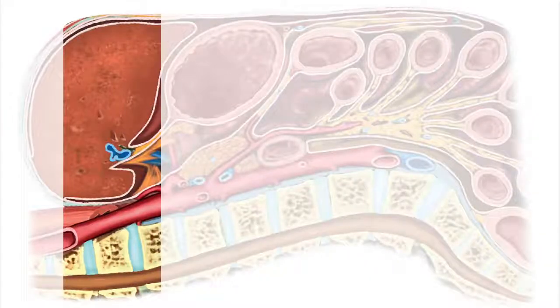So let's begin with the proximal aorta. Once again, this is from the diaphragmatic origin to the origin of the celiac axis. Many times this is hidden behind the liver. You can view it in the transverse or sagittal planes.